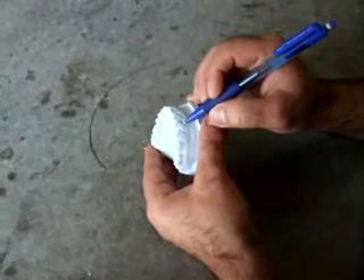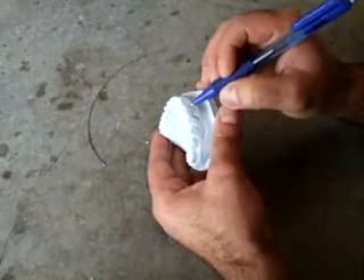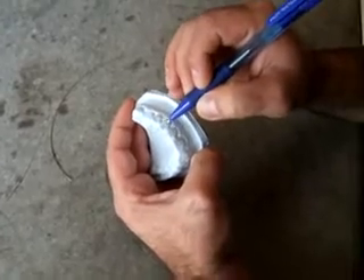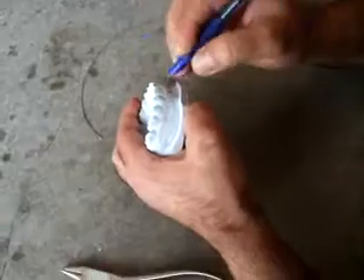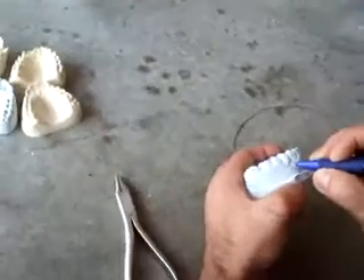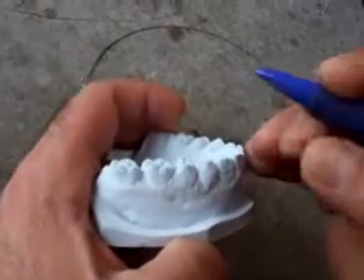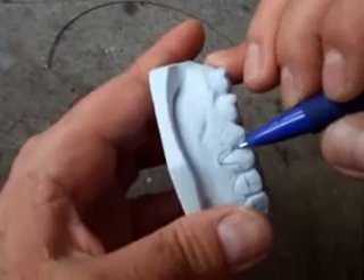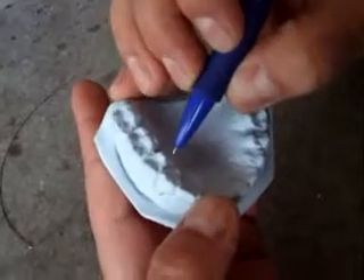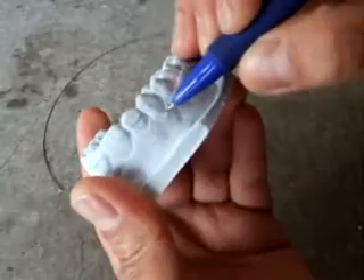We start the retainer labial bow in the middle third of the centrals until reaching the middle of the canine, where we do a loop. The wire goes straight to the gingival line or beneath by one millimeter maximum, just for adjustment. Then go to the distal side of the canine and pass through the embrasure between the canine and the premolar to the palate directly. The other side is the same.